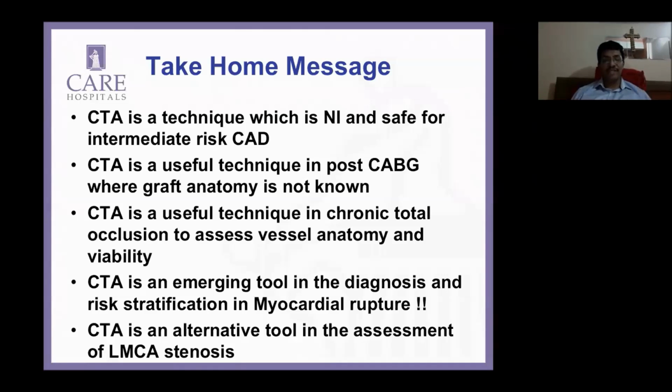of non-calcified plaques, which are completely invisible on a calcium score. So I'm actually more careful when the patient is younger with symptoms. Right. Now that you can assess the plaque nature also, the vulnerability of plaque also, CT angio would be better rather than just going for a CT calcium. Yeah. We are now looking at plaques very differently than what we used to look at.